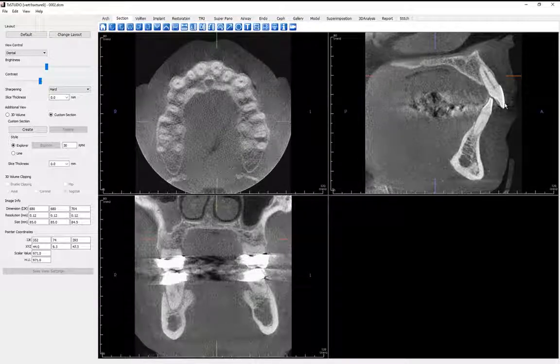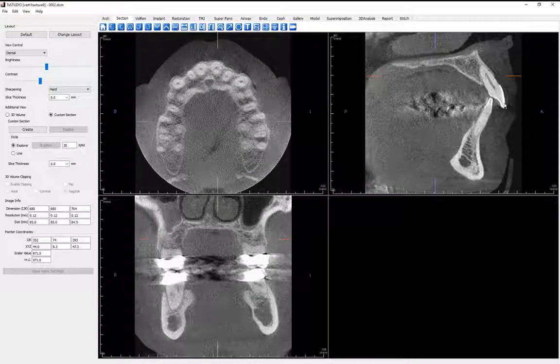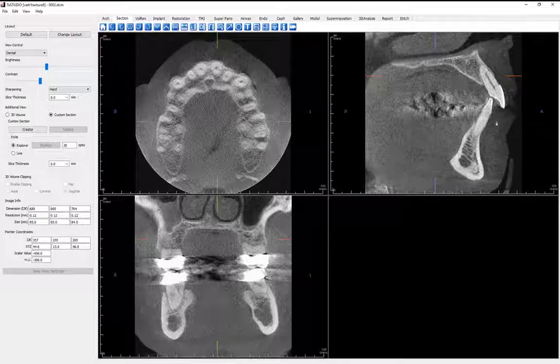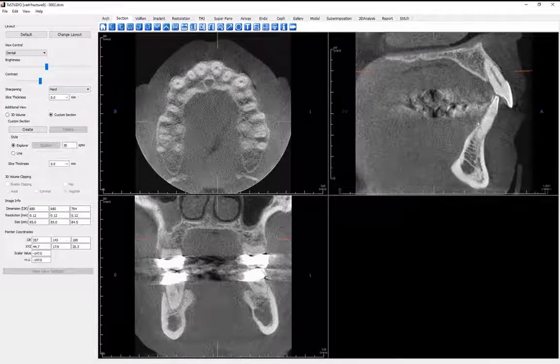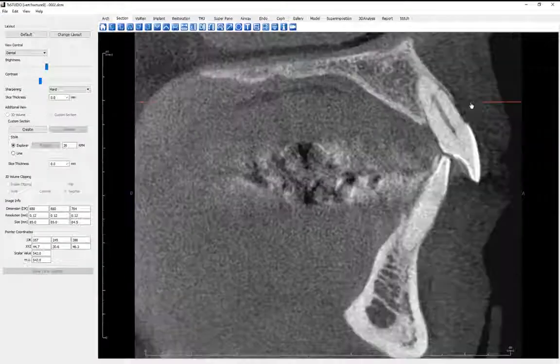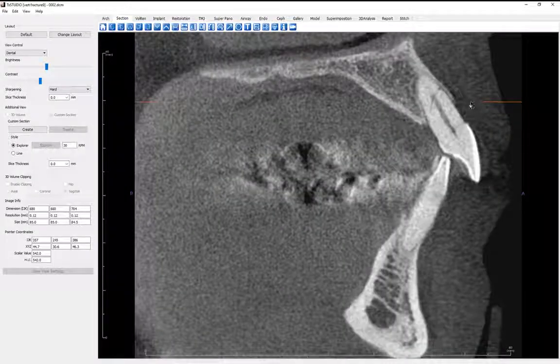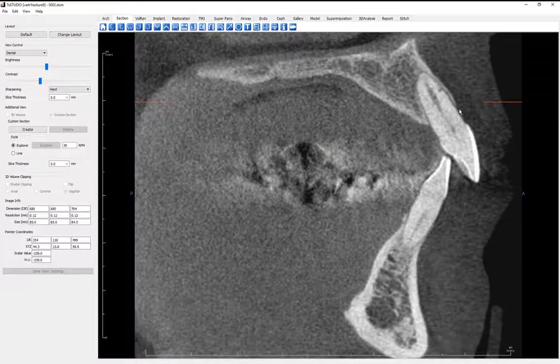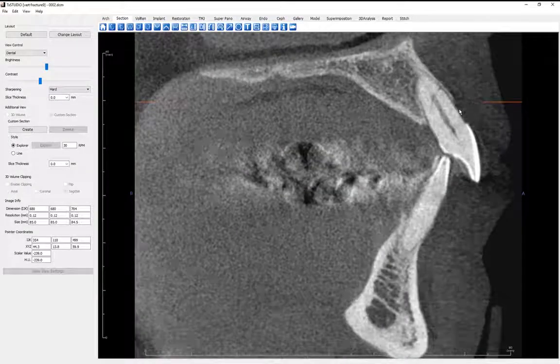To enlarge the image, press the Ctrl keyboard key and the left mouse button and drag the mouse. You may also double-click on the rendering window to enlarge and isolate the image, and again to close it.